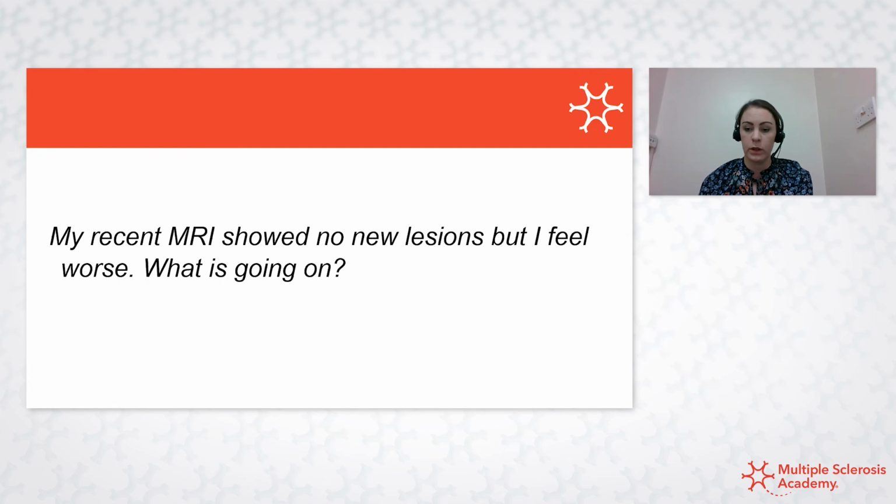And I think as Audrey mentioned, we're just not good at picking that stuff up with the MRI scans that we currently acquire, and hopefully we're going to get better at that in the future. But I guess we're now in a situation where we have got medications to offer people who are progressing on another DMT, even with a stable MRI.